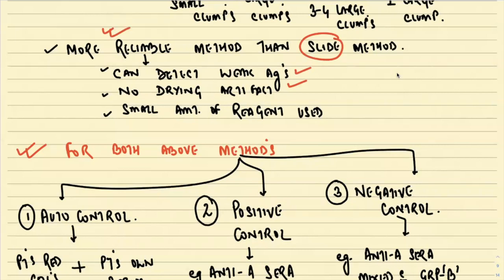For example, sometimes if I cannot attend my laboratory, the technologist performs the blood grouping by the tube method in the morning, and he just keeps it. When I go to the lab at night, I just check it, because it is in liquid form, so nothing is going to happen, and I can check the grouping at any point of time. And very important, it saves on the reagent. Very little reagent is required for this particular test.